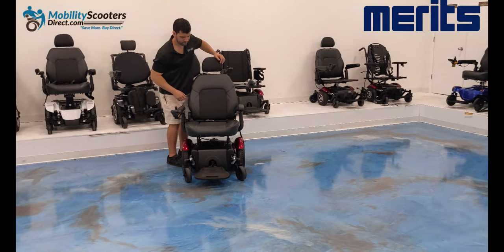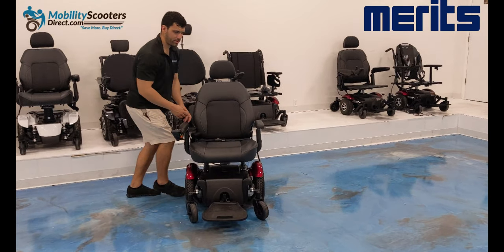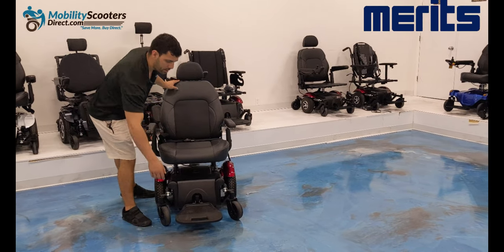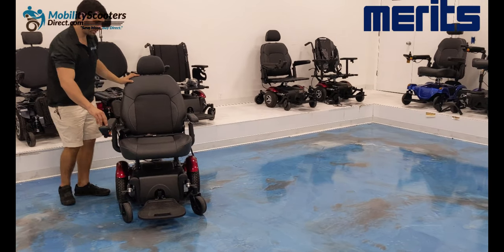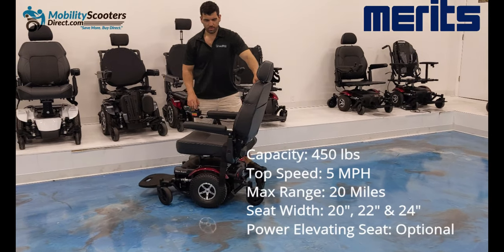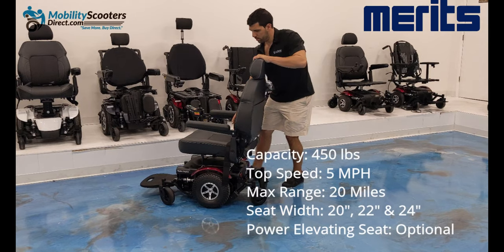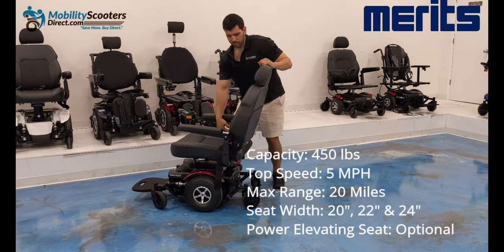It comes with flip-up armrests, a seat belt, and a height-adjustable headrest on a captain's chair, which has the option to upgrade to the elevating edition, allowing you to raise the chair automatically up and down. The foot plates flip up and are height adjustable. The weight capacity is 450 pounds, with a top speed of 5 miles per hour, and on a full charge it can go up to 20 miles. It also has several seat options.